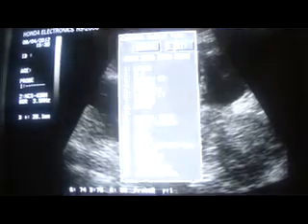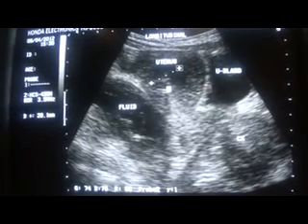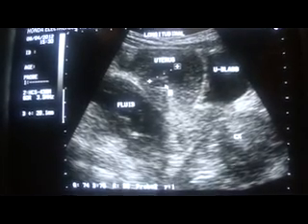and you see that the endometrial canal is dilated up to 22 by 13 millimeter, contains a lot of debris along with fetal retained product.